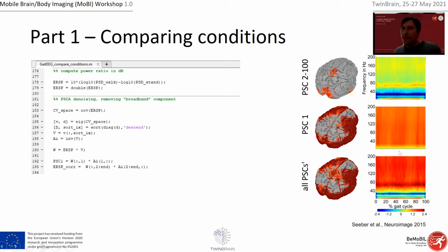That's exactly the spectral profile we were showing in this paper: yellow means low power, red means high power, and that's quite consistent across participants, but also across time. It's very stereotypical, meaning the uncorrected data looks like this in time, frequency, and space. If you always look at the first principal spectral component and remove it, meaning this minus this results in that, we have a much nicer time-frequency plot that is not that much affected by these artifactual activities.